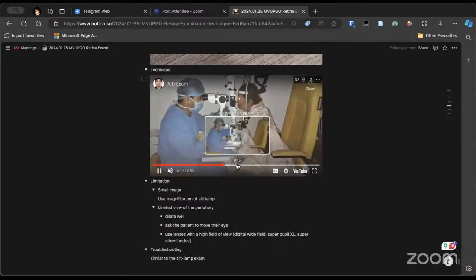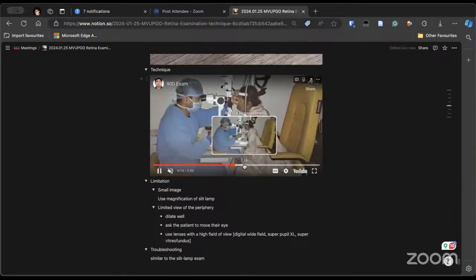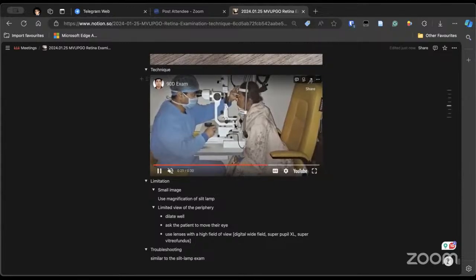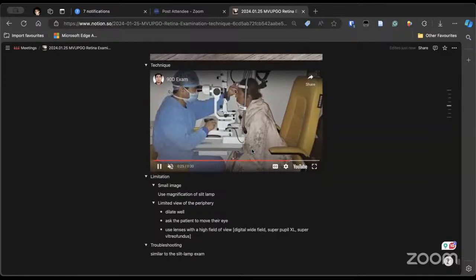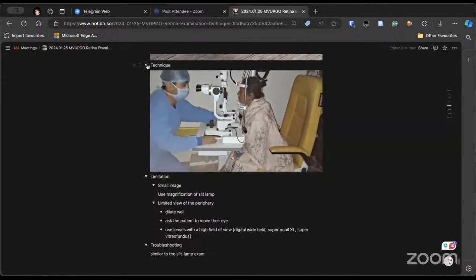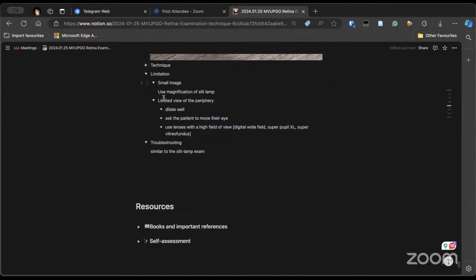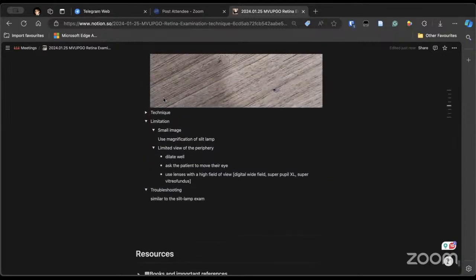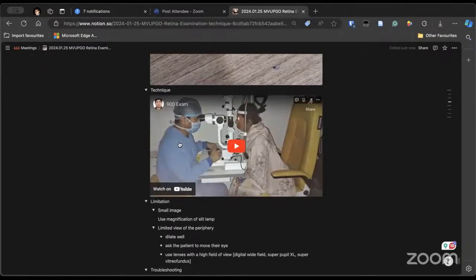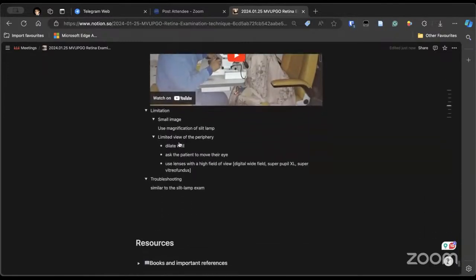But I use the same hand for both. It is also okay to use the same hand. You should be comfortable in doing this. But in detailed ophthalmoscopy, it is actually difficult to do with the other eye. Yes, I saw that I'm doing it with the left hand only. So it is whatever you are confident with.